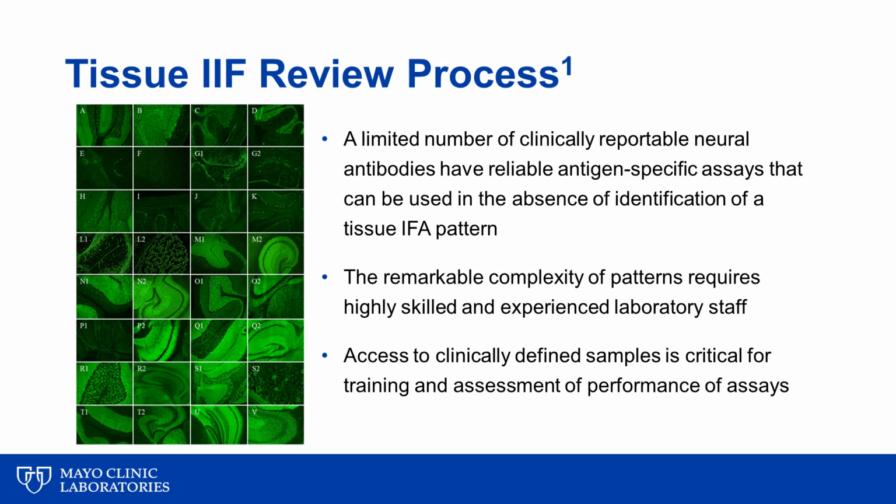The figure on the left is shown as a representation of some of the staining patterns of reportable neural antibodies and demonstrates the diversity of staining patterns and some of the subtle differences between antibodies. The use of tissues from critical regions of the brain within a single composite is an essential aspect to this testing.